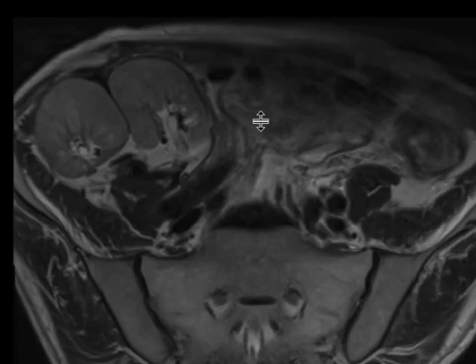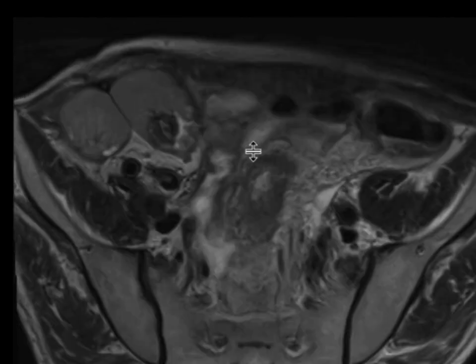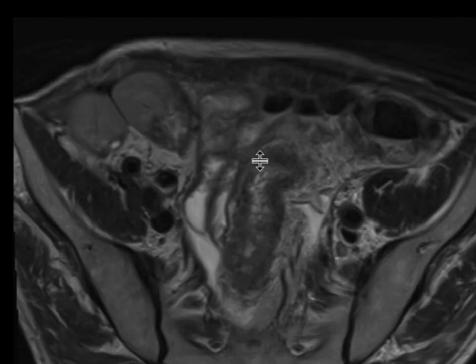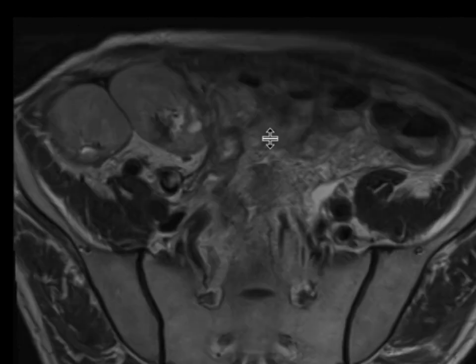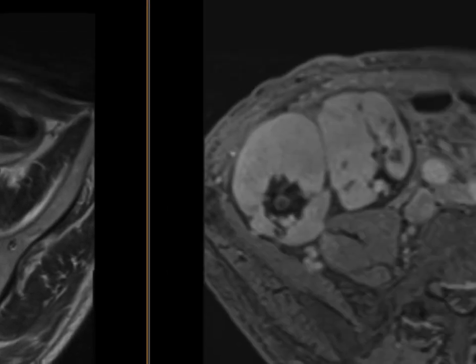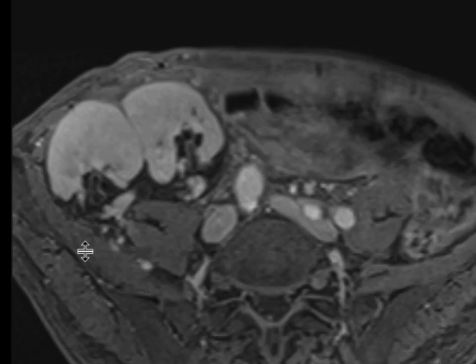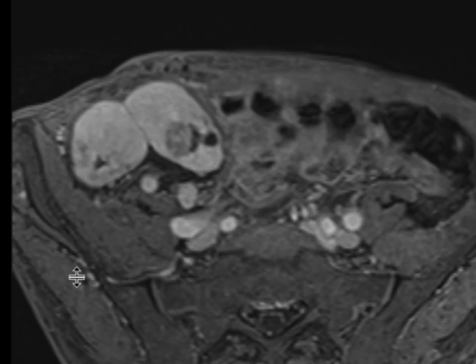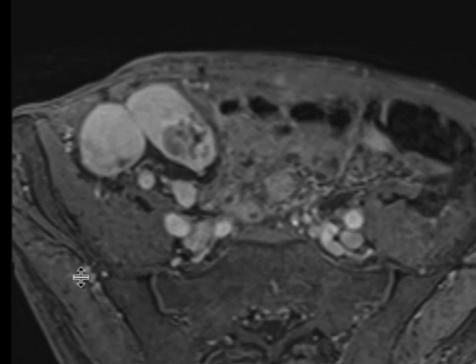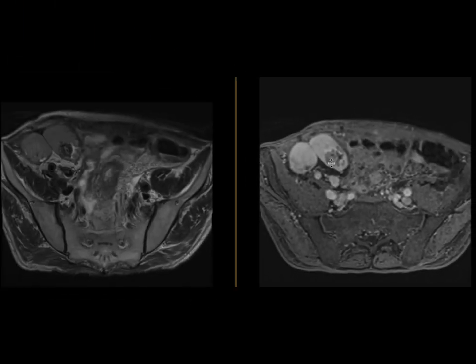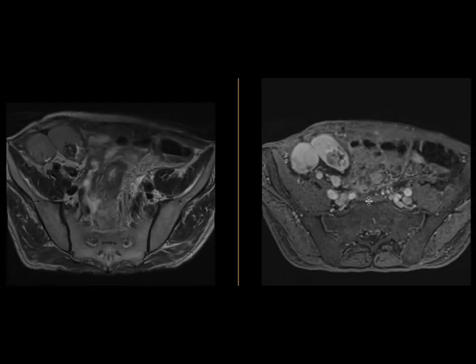We can see on the T2-weighted sequence that within the more medial of the two kidneys, there's this round, relatively T2 hypointense mass. There are some areas of high intensity within it as well, and we give contrast because there's enhancement associated with this. And so this is a renal neoplasm.